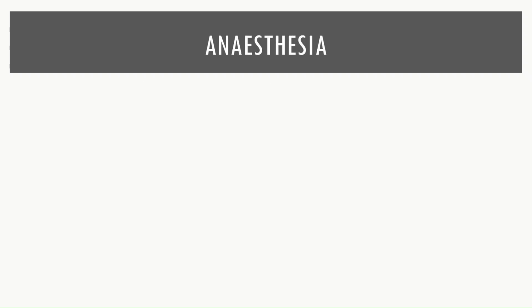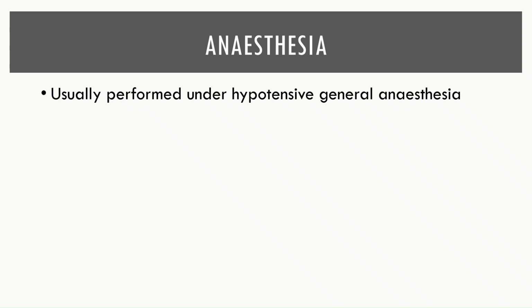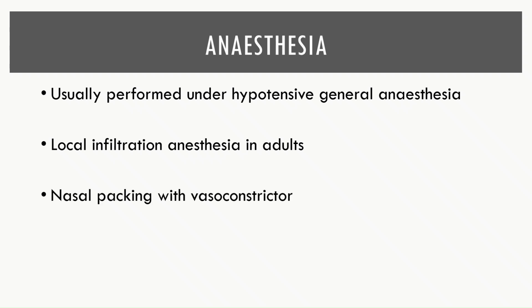The surgery is usually performed under hypotensive general anesthesia to reduce bleeding with the patient in supine position. However, local infiltration anesthesia can be given in adults, and nasal packing is done using a vasoconstrictor.